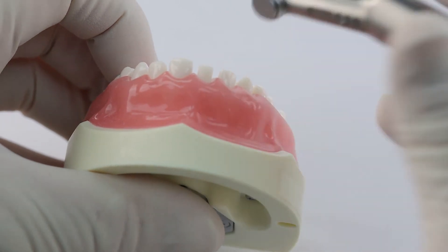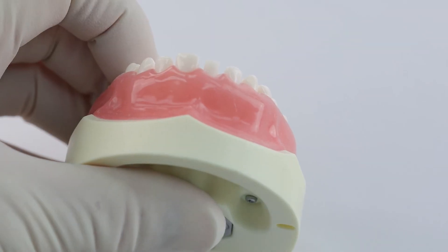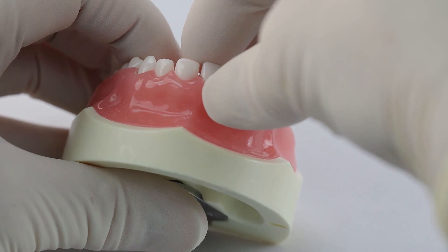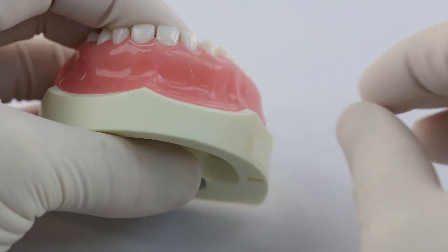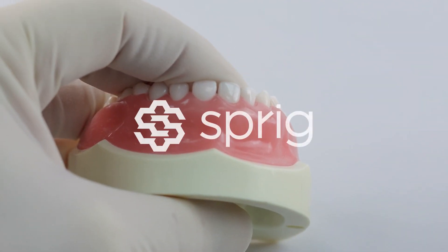Completed preparation. Do you need to round the edges? It's optional. Now we can try our tooth on — with practice your tooth should fit on the first attempt every time. And it does. There's our finished restoration.